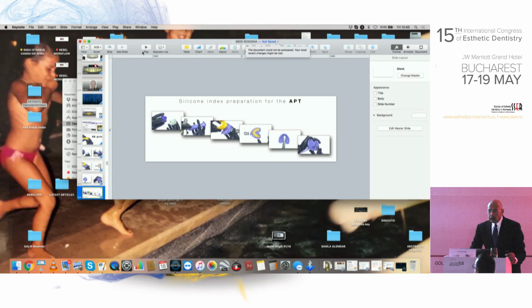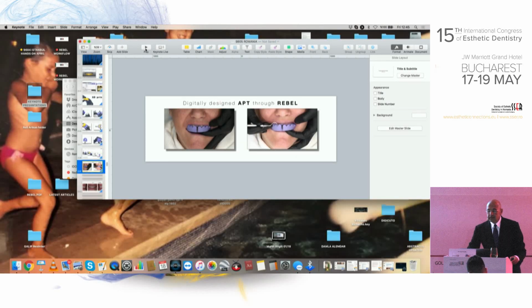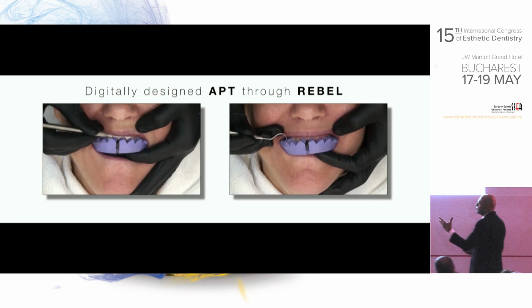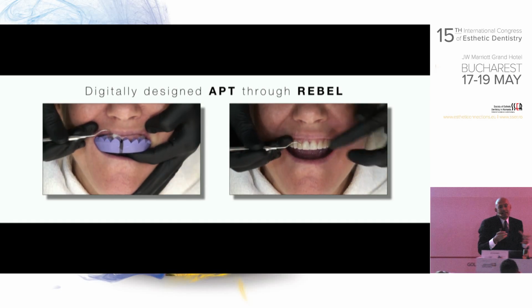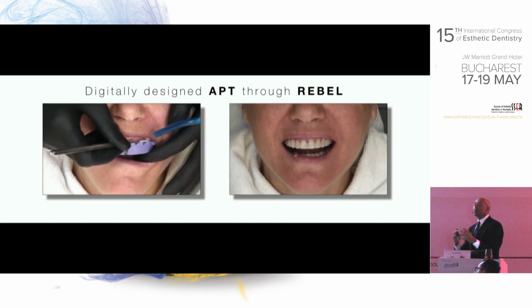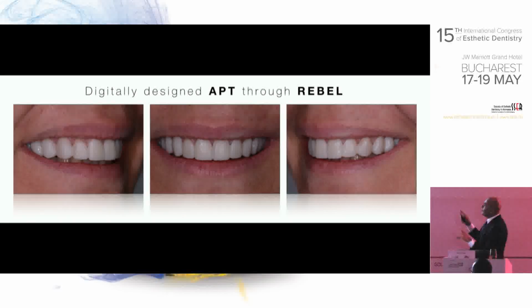Application of this into the patient's mouth, just like we do the regular APT transfer, and this is what we do. We load the tray with Luxatemp. This is my winner material since been using 20 years. And look at this. Once you take it, it's the unbelievable design that comes out immediately. And you don't need an intermediate great ceramist to do this wax-up for you. So once we have this, the patient can see that.